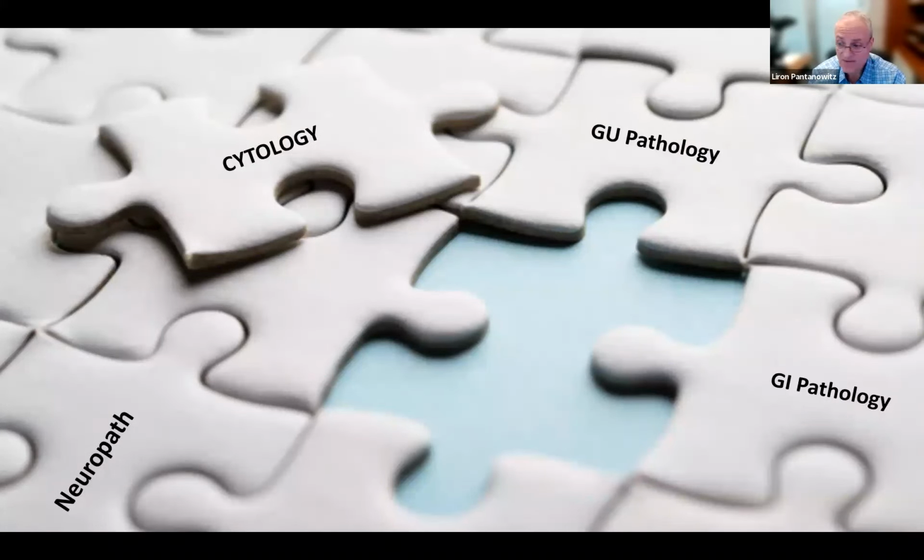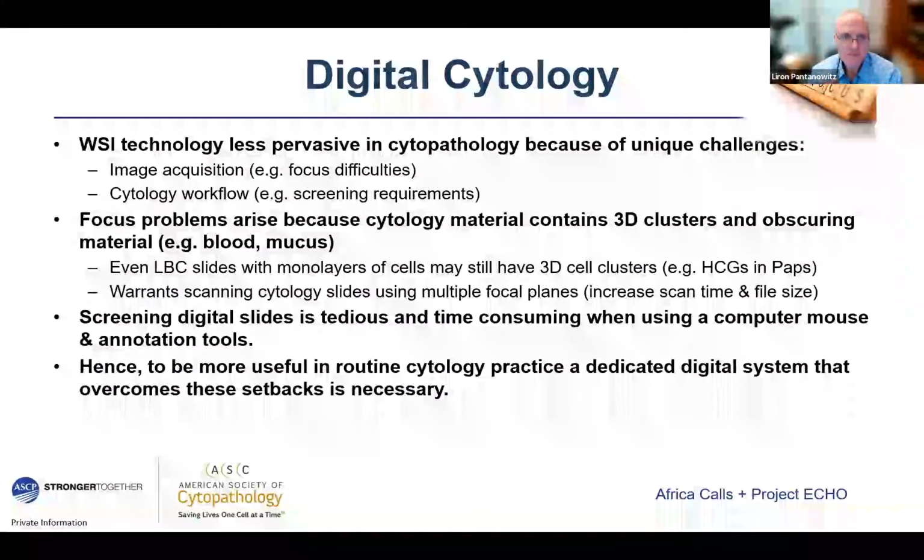People scan slides for education and research, but to actually screen and sign out those cases, very few labs have started using digital scanners for digital cytology.